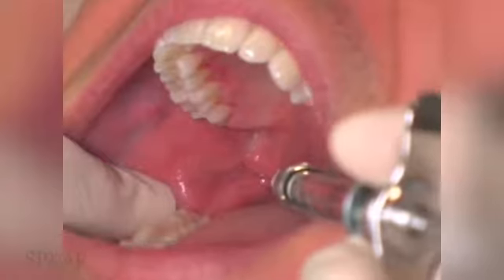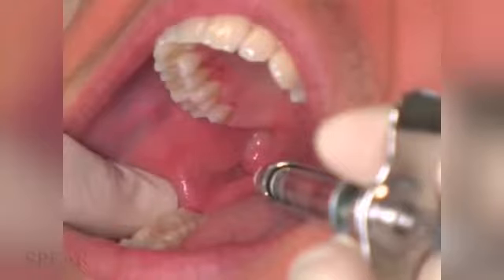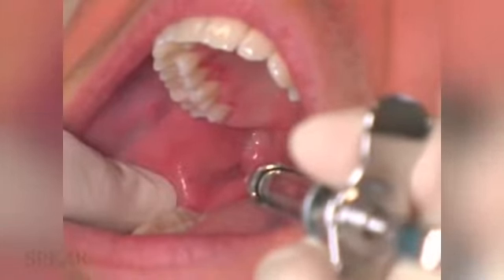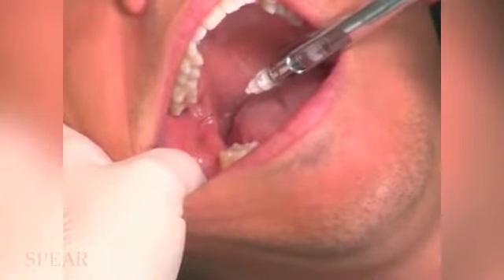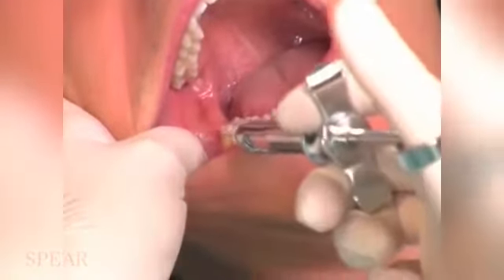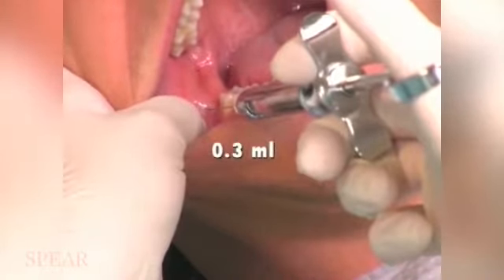The needle is then inserted and advanced slowly until bone is contacted. The average depth of penetration is between 20 and 25 millimeters, which is 2/3 to 3/4 the length of a long dental needle. Once bone is contacted, aspiration is performed twice, and if negative, 1.5 to 1.8 mLs of local anesthetic is administered. The needle is withdrawn, the syringe is repositioned, and the needle reinserted in the mucobuccal fold distal to the last mandibular molar. 0.3 mLs of anesthetic is administered.